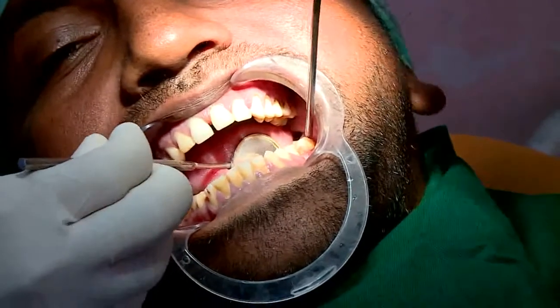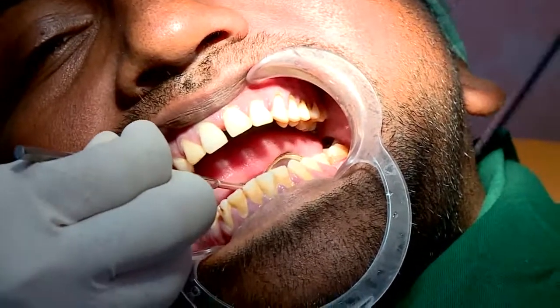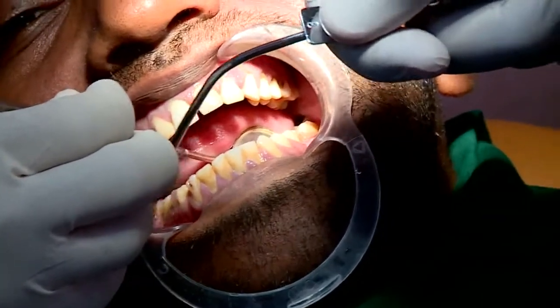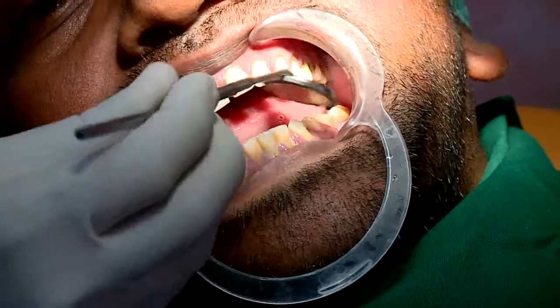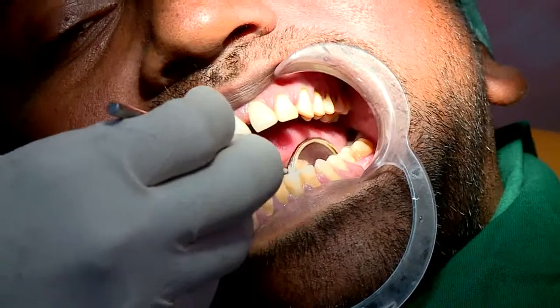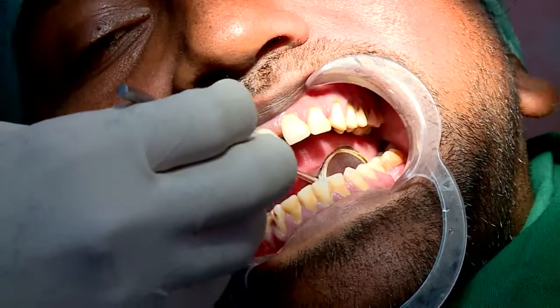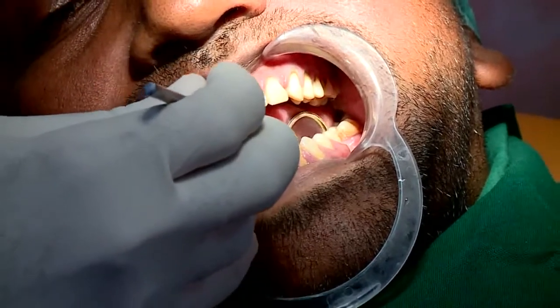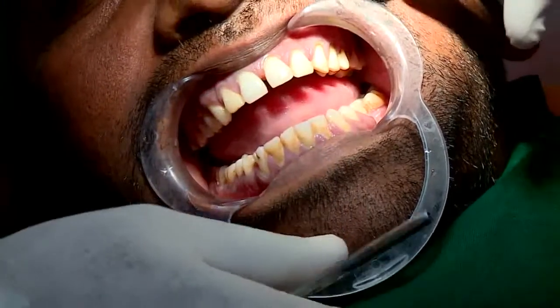Right, so now as you see, this gentleman is missing the lower left first molar. So it's a 3/6. The radiograph was shared with me earlier. Now what we are planning for him is, now close your mouth sir.